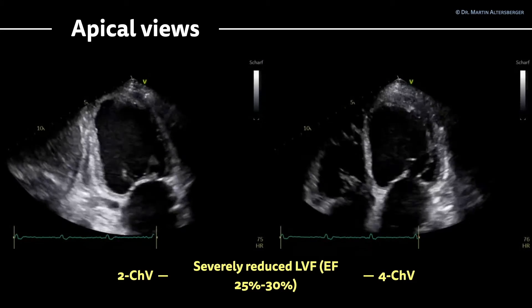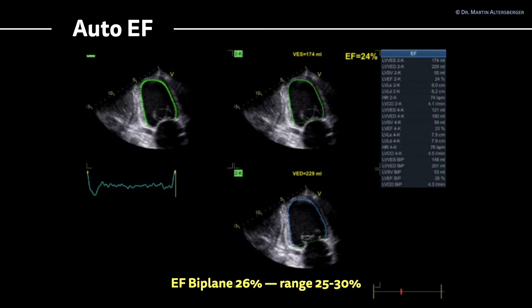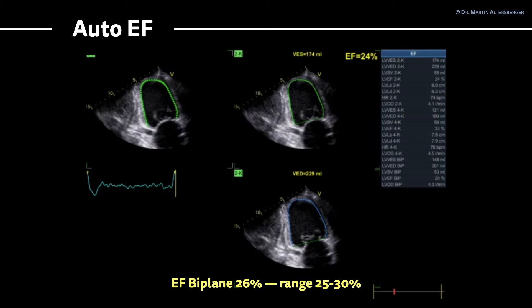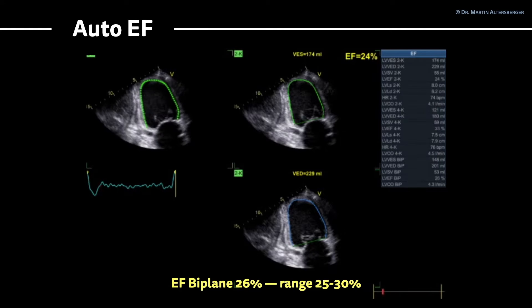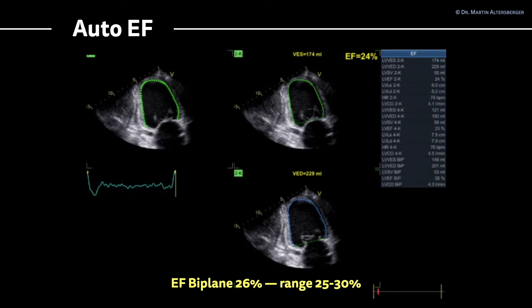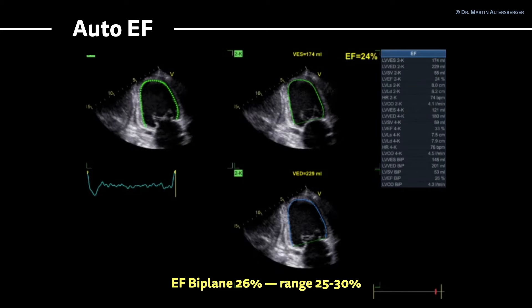The ejection fraction is in the range of 25% to maybe 30%. Using auto-ejection fraction calculation, the machine calculates the ejection fraction in the apical 2-chamber view at 24%, in the apical 4-chamber view at 33%, and overall a biplane ejection fraction of 26%. As a tip, in your report you should always write down a range — in this case 25% to 30% — to accurately describe the severely reduced left ventricular ejection fraction.